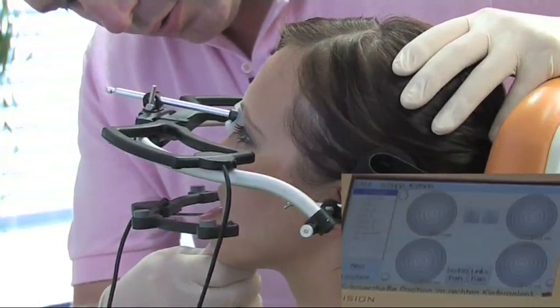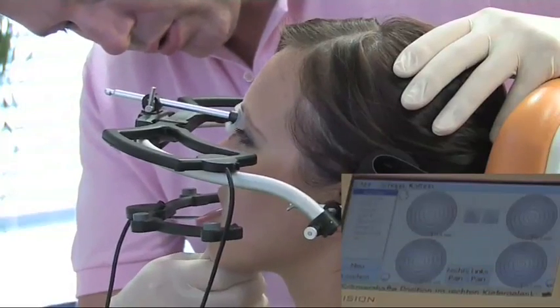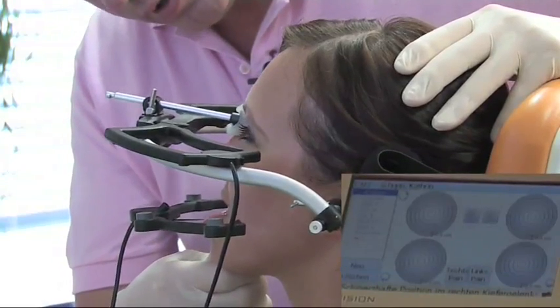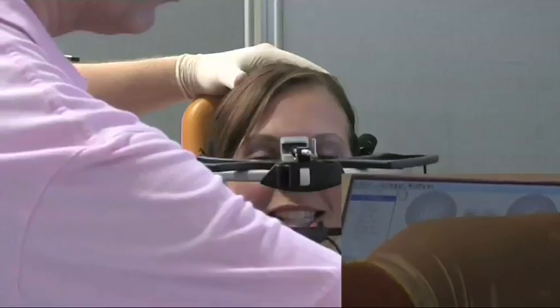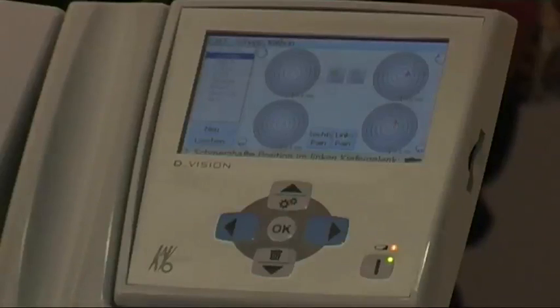As soon as you feel any pain, simply raise your left hand. Okay, when it hurts, raise the left hand. That was the site of the pain, on the left side. You can see that we have marked it here, there, where the red crosses are. That is your condyle when you have your pain. So we now know where the condyle is when the pain appears.